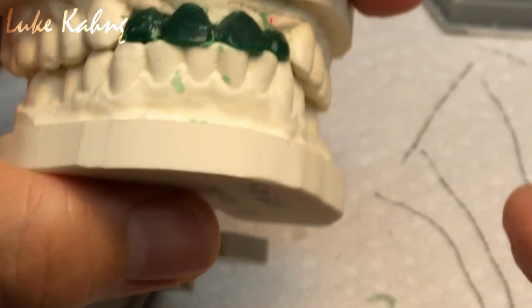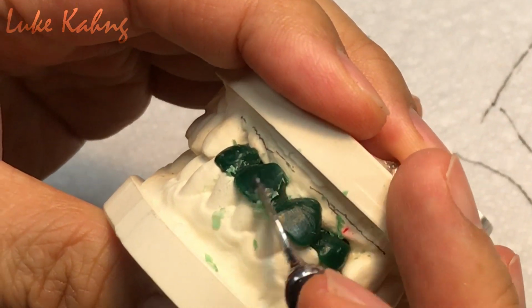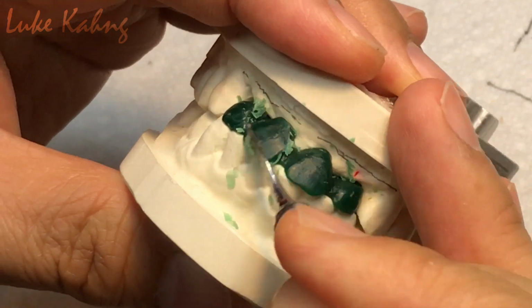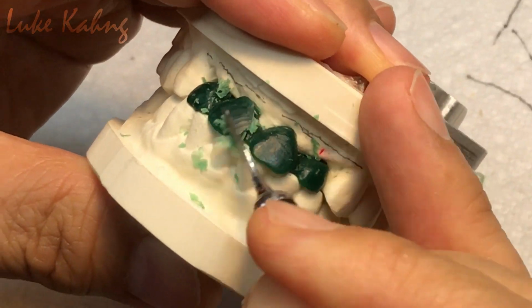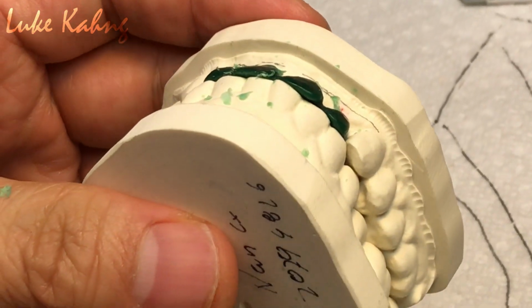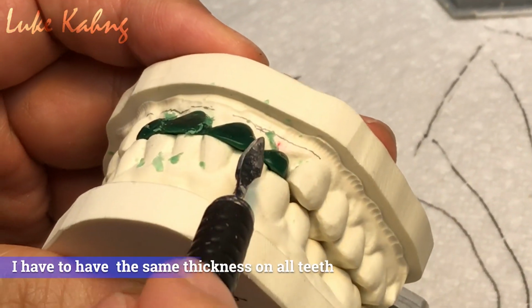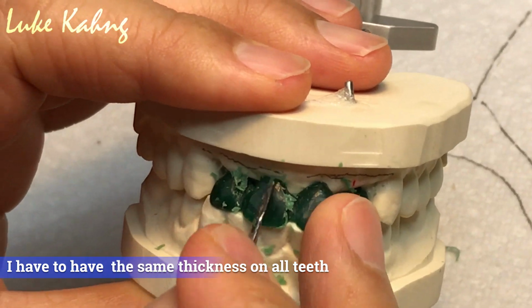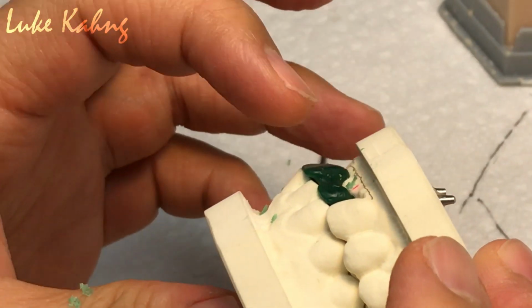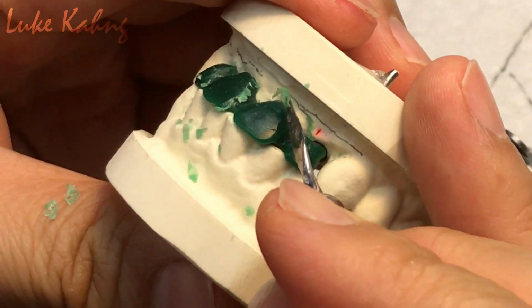So once you're done with the one, you see, that's how much I need. Now, domino effect, I have to move to this. So whenever I cut it, same thing, I have the same thickness. Why? Because this is a pontic, too thick. So I cut it.